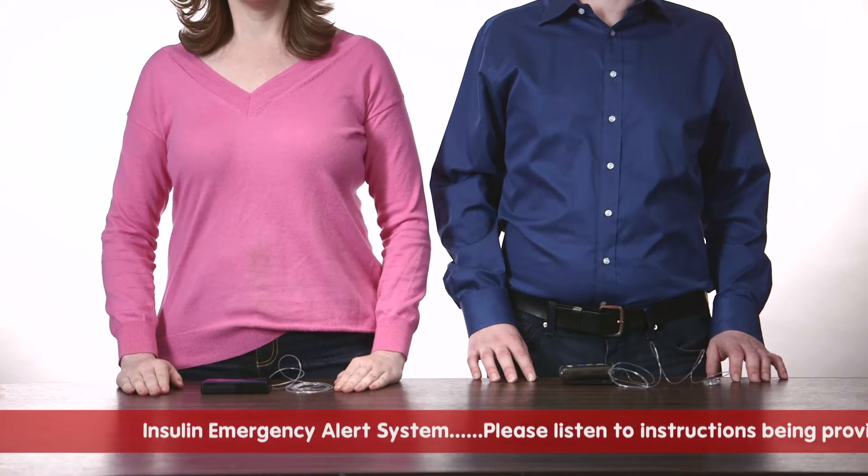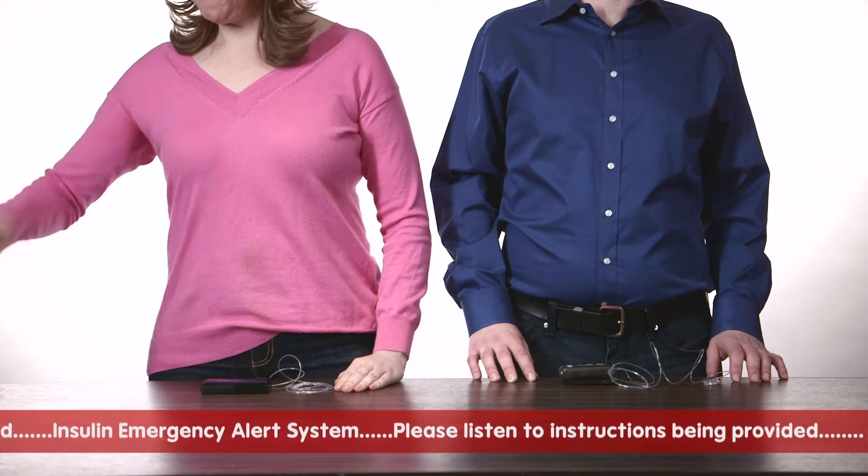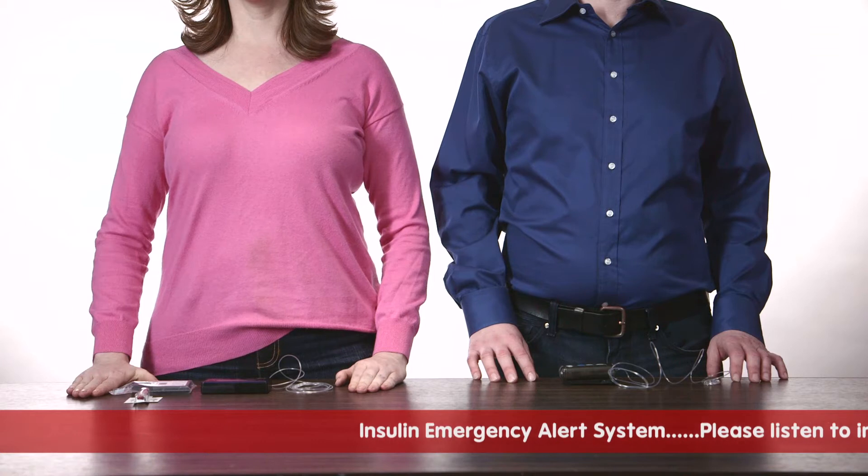If you are living in the area and have a snap pump, please find a replacement pump body and insulin cartridge. If you do not have a snap pump, please call your pump manufacturer's customer service line.